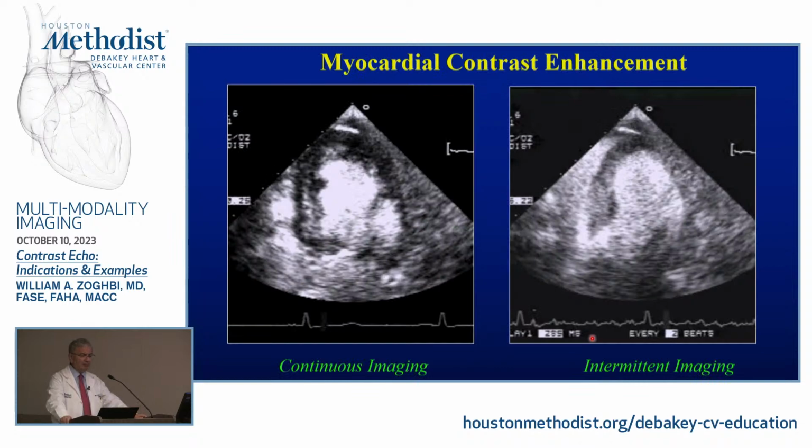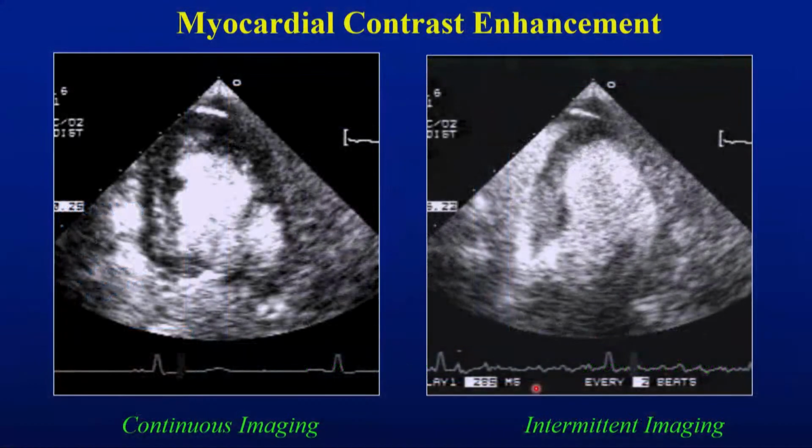And this is an example. There you go. I'm seeing in real time on the left, myocardium is dark. And that's part of the reason that when I enhance the cavity, I don't enhance as much the contrast if I use regular settings. Just decrease my MI and use real time. You understand?